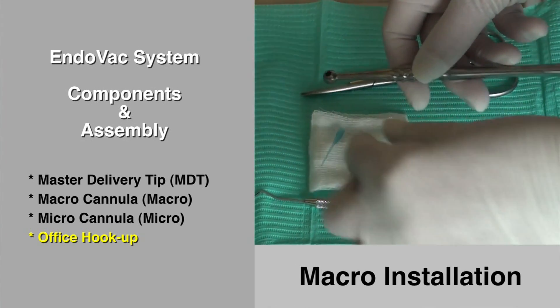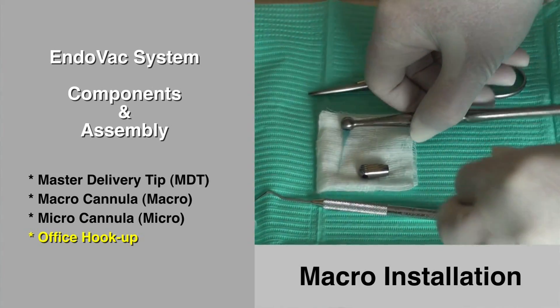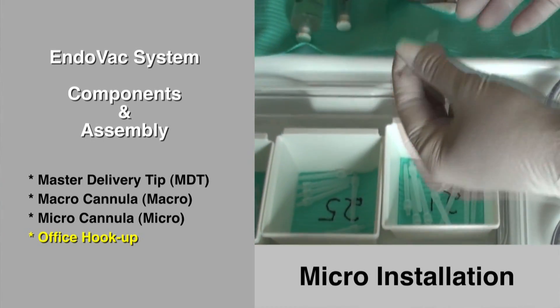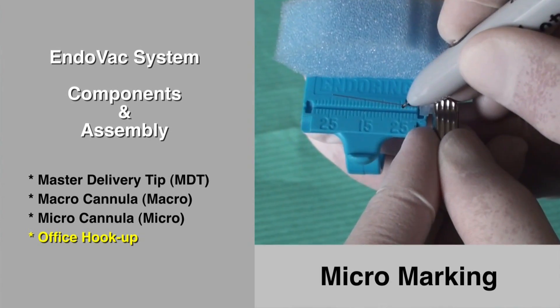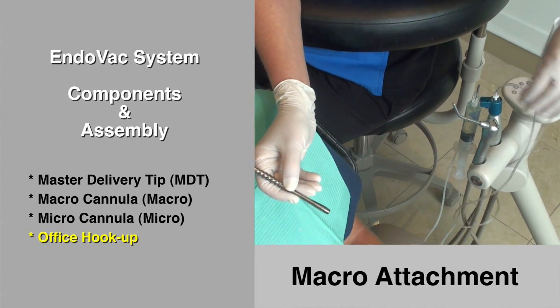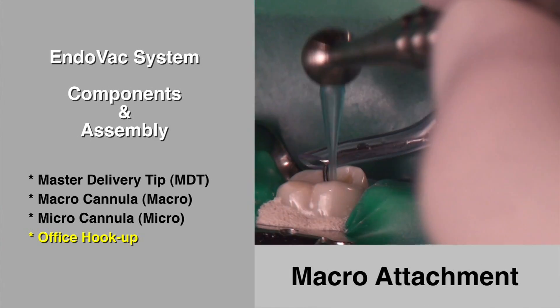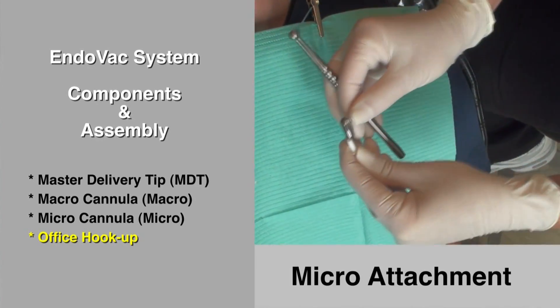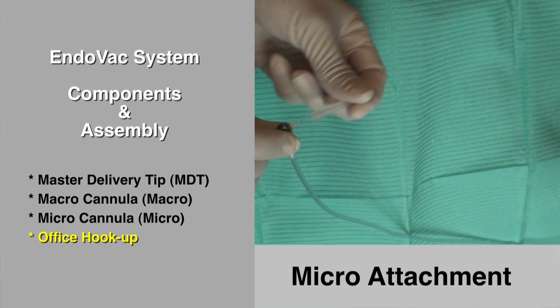After instrumentation, a macro cannula is then placed into the handpiece. Then, depending on the length of the canal or canals being treated, an appropriate length micro cannula is selected and firmly inserted into the finger piece, and working length is marked quickly with a waterproof Sharpie pen. The white connector closest to the master delivery tip is removed from the multiport adapter and inserted into the back of the handpiece. After use in the canal system, the handpiece is replaced with the finger piece. The cap is removed and final irrigation begins.